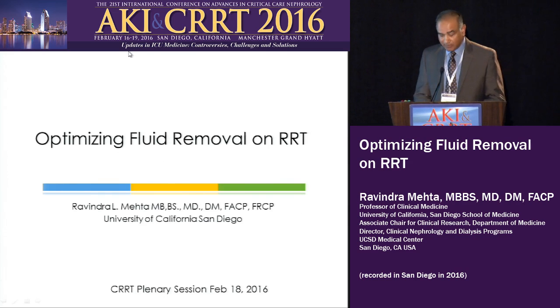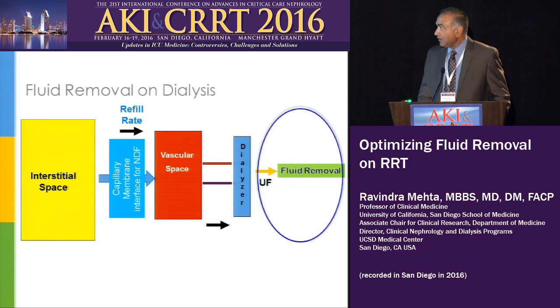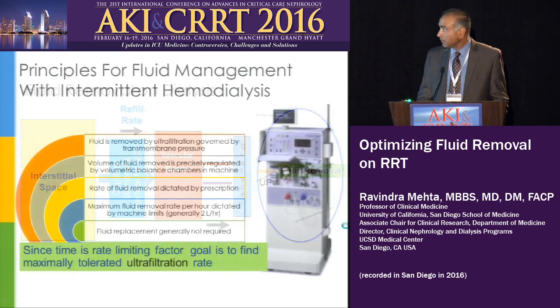I think, following up on Dina's presentation, one of the key issues that comes up is how do you manage fluid in patients who are on dialysis for AKI. And this simplistic cartoon is probably very evident to all of you. The only way we access the vascular space is through the dialyzer, but we are not accessing the rest of the fluid, and we are dependent upon movement from the extravascular space into the intravascular space to access and remove the fluid.